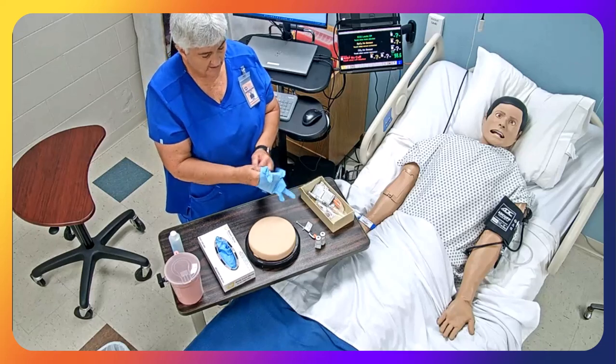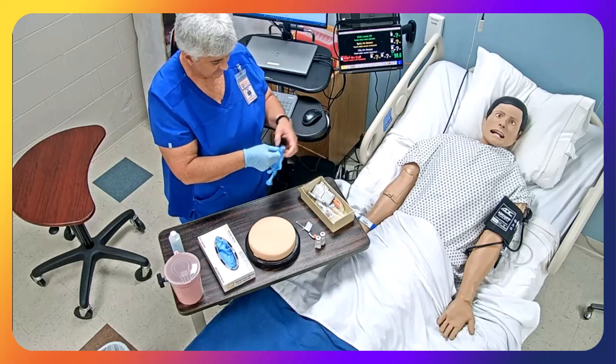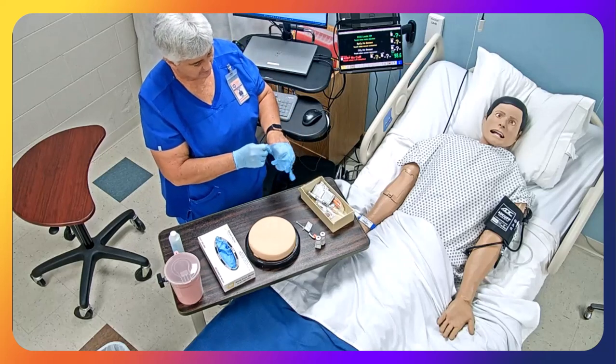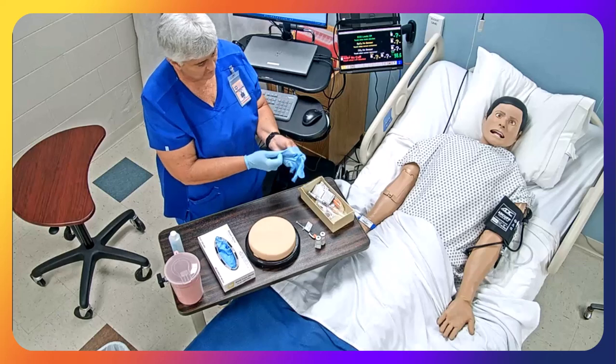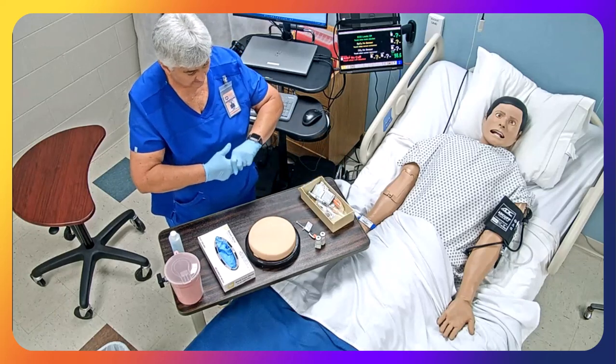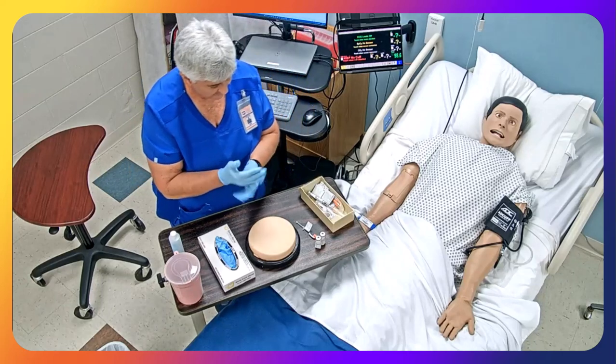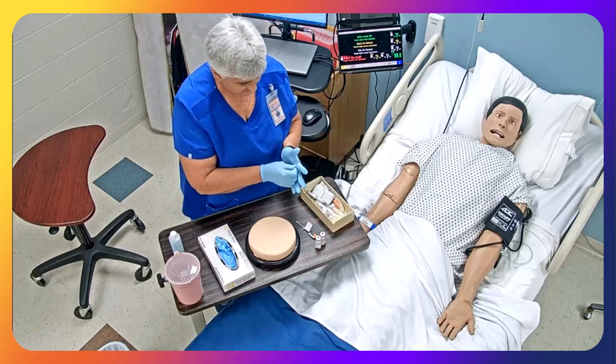And then we know that we never recap a needle that has been used for injection. Okay, just checking the integrity of my gloves. You never want to leave your medications unattended.